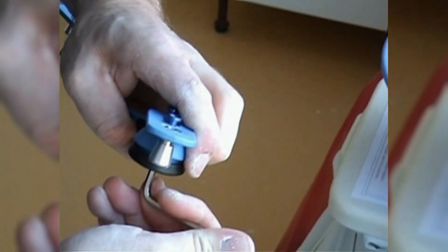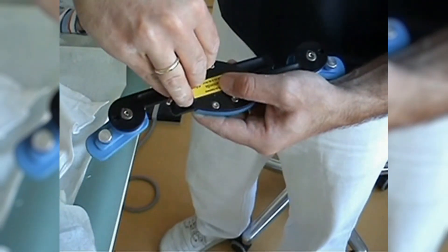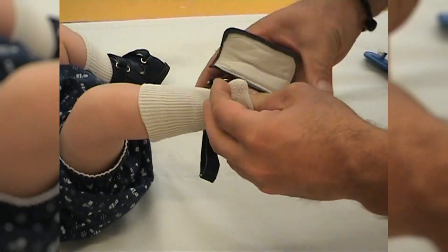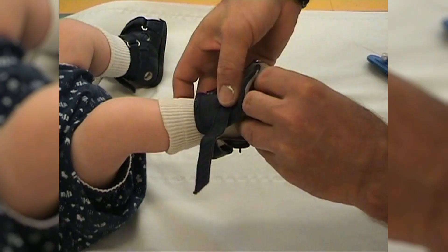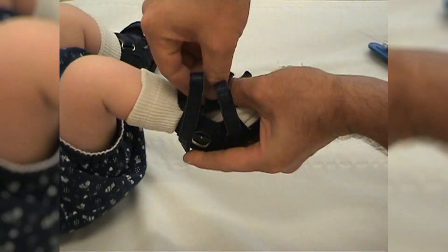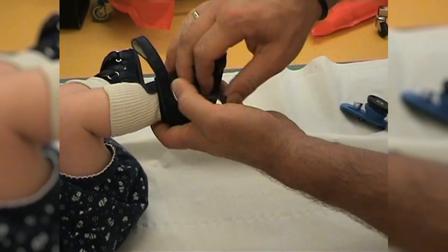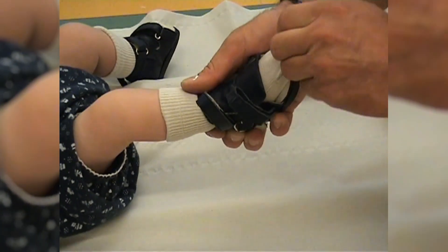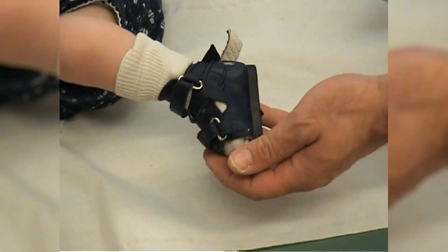The heel to heel distance should match the shoulder width. You then adjust it individually by using the screws in the central plate. When putting on the sandals, which have been specifically designed for club foot treatment, you must pay attention to the correct position of the heel. It can be ensured by tightly fastening the middle strap. Once the patient is wearing the shoe, you can check the position of the heel through the window on the internal side of the shoe.